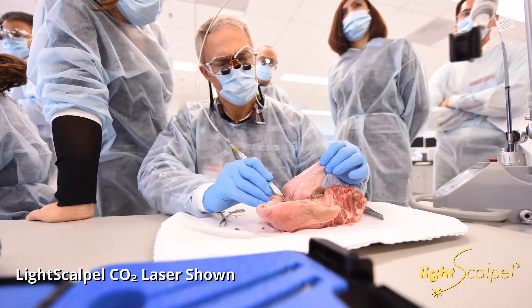Looking at the different options, the LightScalpel seemed to have the best combination, the best bang for your buck, so to speak. For soft tissue procedures, I think the CO2 wavelength is the best.